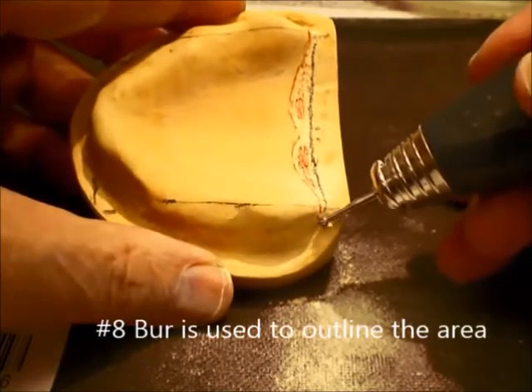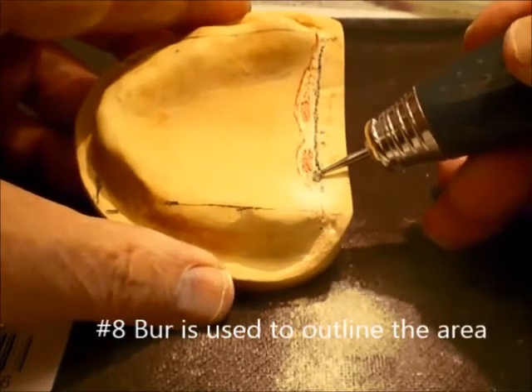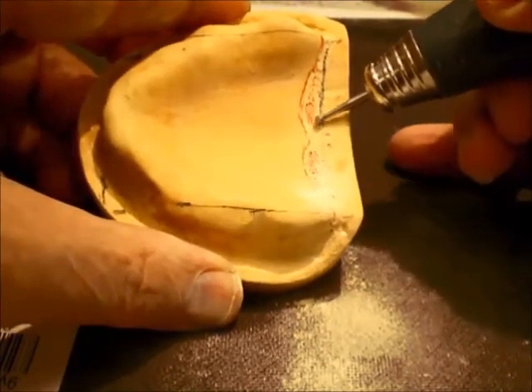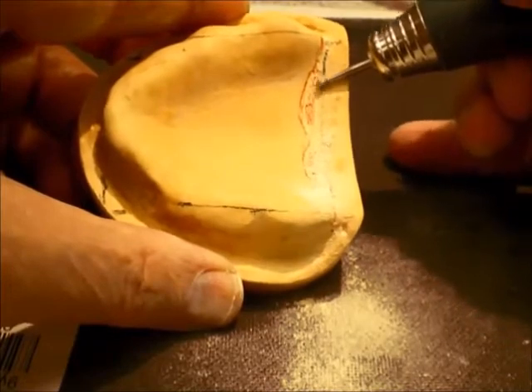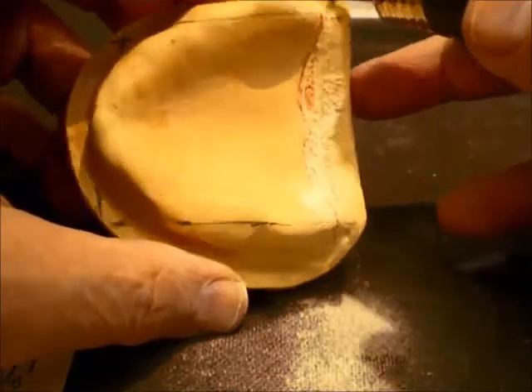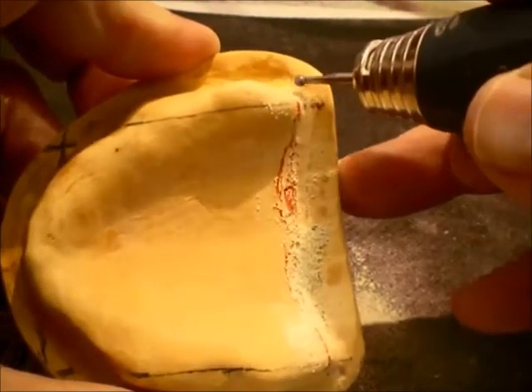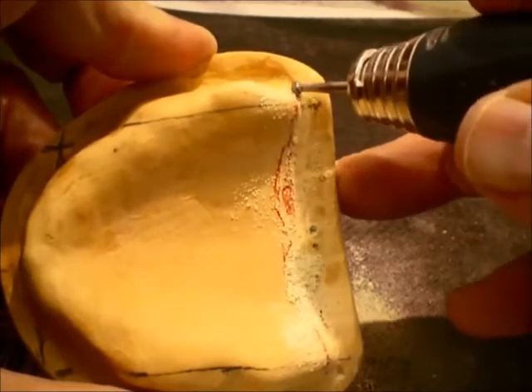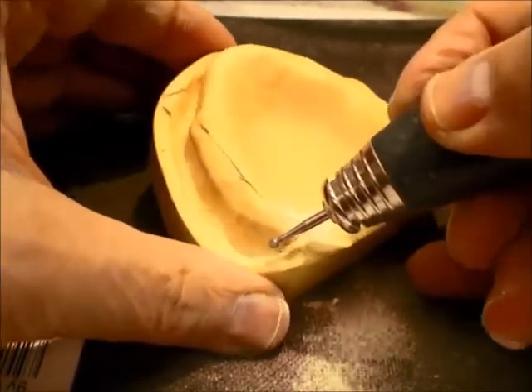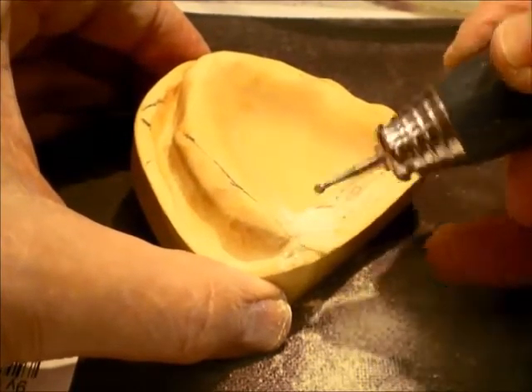This is a time-tested method. You will see that I am removing stone and outlining the posterior palatal seal area with a number 8 round burr, proceeding through the hamular notch about 3 mm. The width of this area is about the width of the number 8 round burr, and the depth is about half the width of the number 8 round burr. It goes through the hamular notch bilaterally.